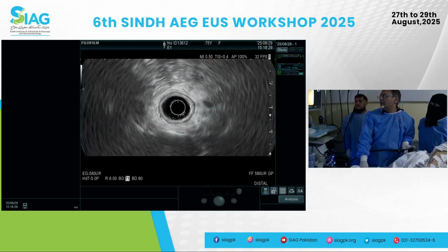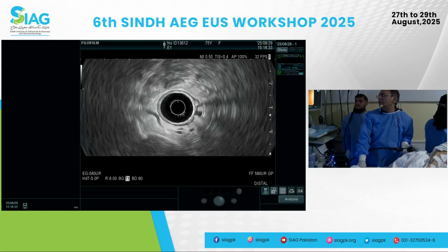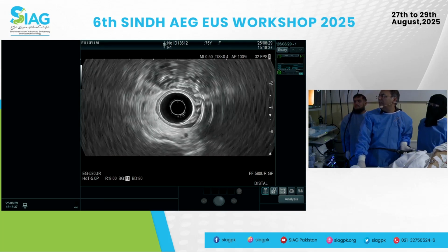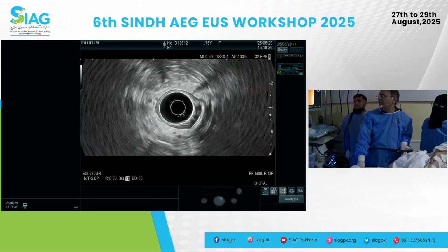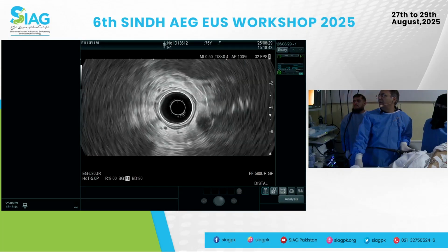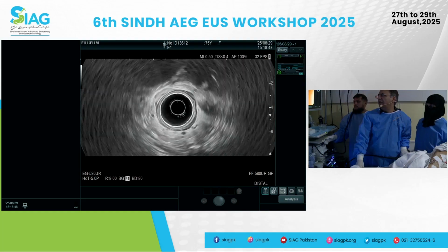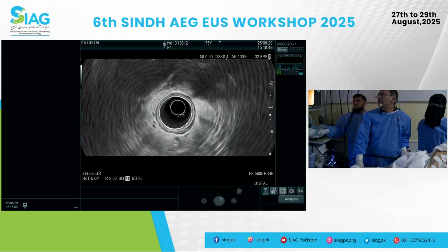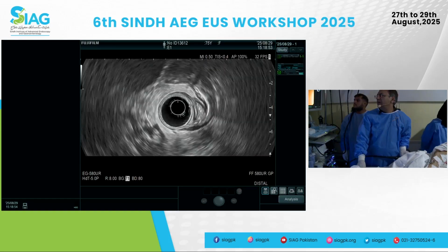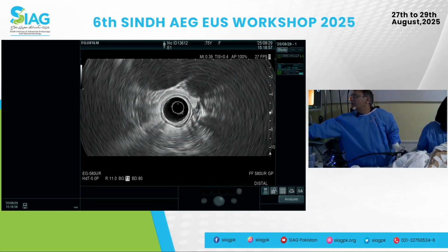My goal is to find the bladder and bring that to the top. Right now there is another bowel lumen I see on the top, so I'll come back a little further down and see if I can find the bladder. You see the black structure on the top? That looks like a bladder right there. Let me make the image a little bit smaller.